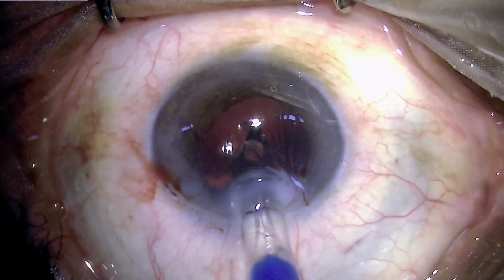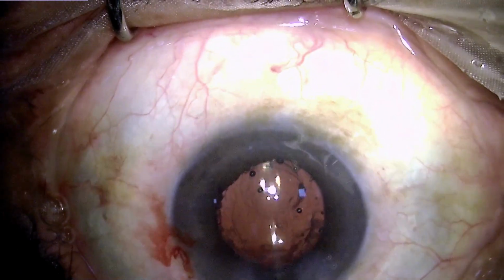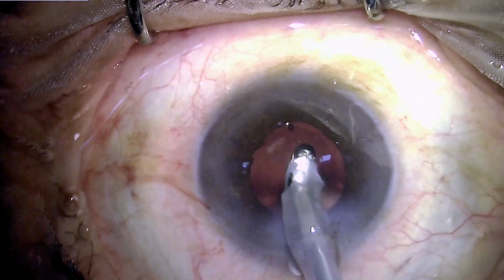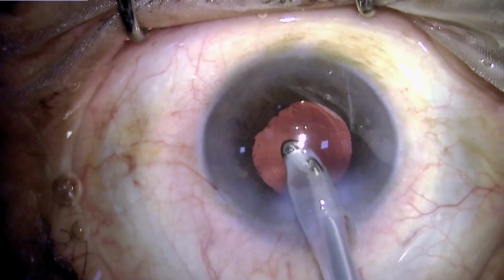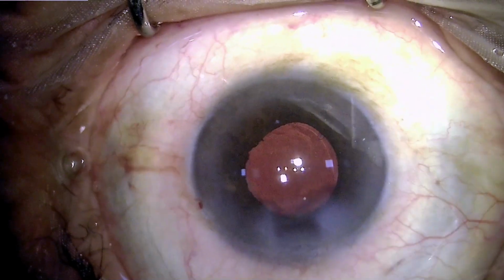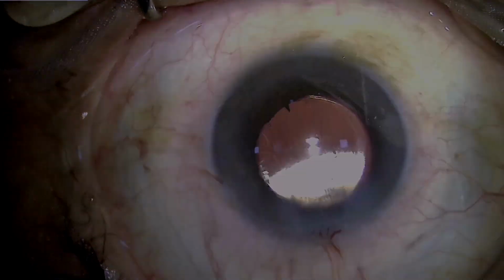So a well-trained staff is an asset who will be able to pinpoint mistakes and more importantly take care that these mistakes don't occur. So it's very important to examine the IV line or any other consumable which is used, because apart from the consumables like knife, chopper, phaco handpiece, the IV line is something which is not in front of the surgeon. So the staff has to take care of these things.